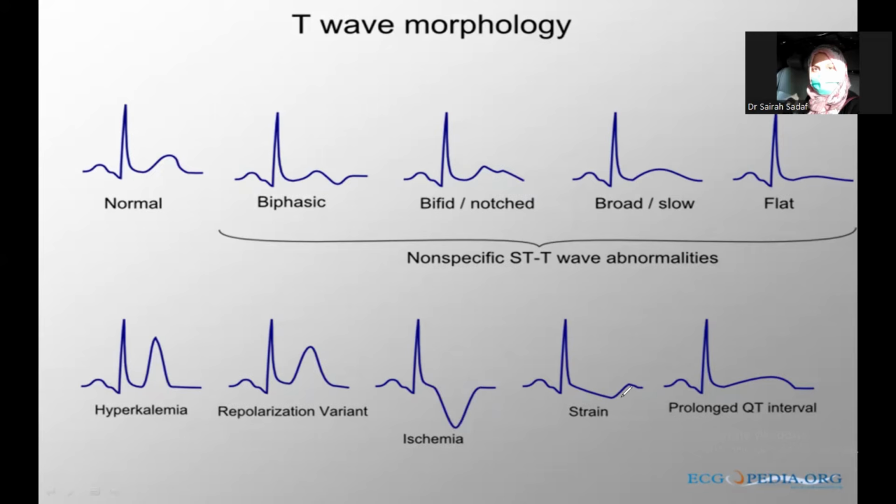This T wave is also inverted. But there's some difference if you look closely at the two T waves. This one over here looks like simple T wave inversion, just like this. Sorry for my drawing, but it's a simple T wave inversion. Rounded, almost rounded, or you can say both sides of the T wave look the same.